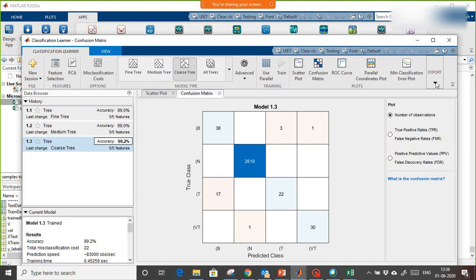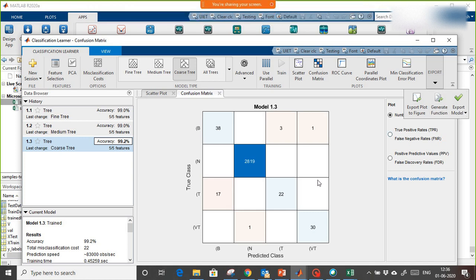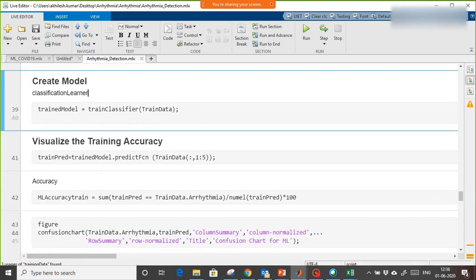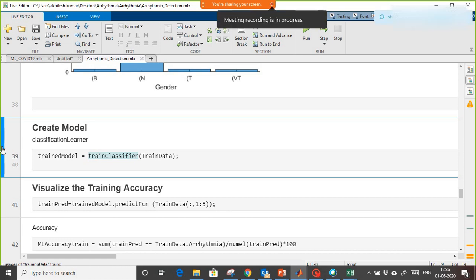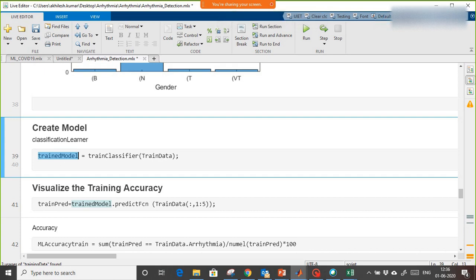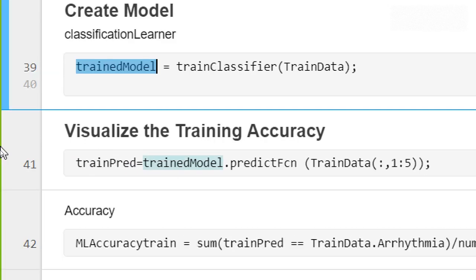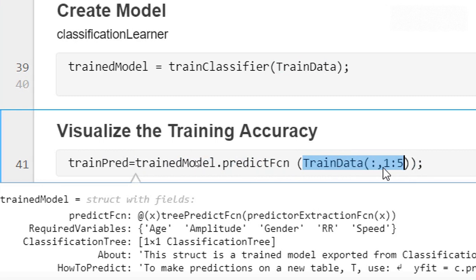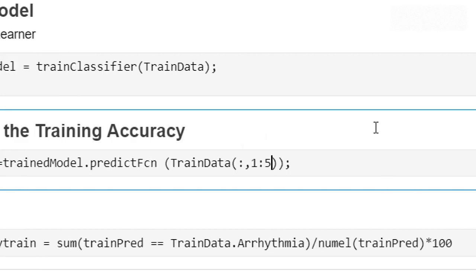After selecting the best model, you can export it or generate code. I generated the code and used it in a MATLAB live script. The trained model is loaded, then we predict on training data using the model's predict function, reading columns one through five — excluding the output column.